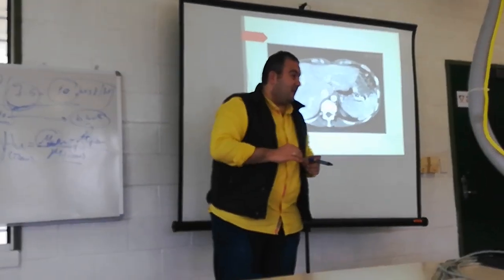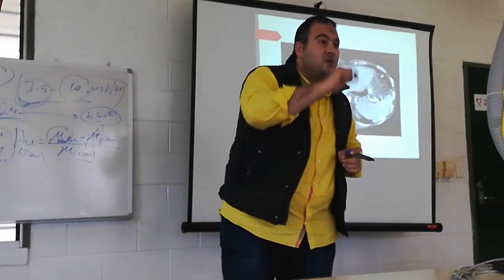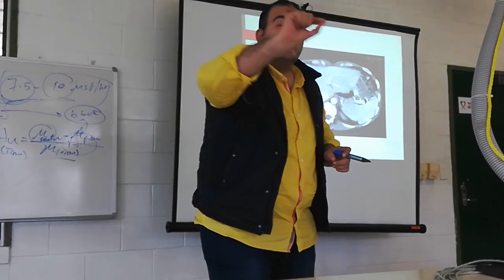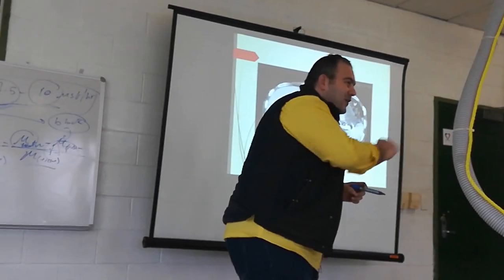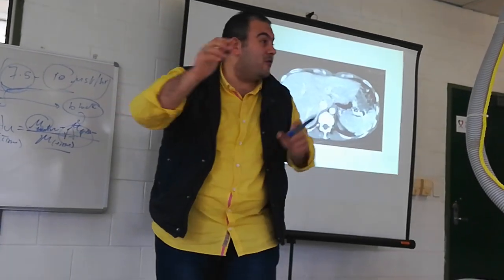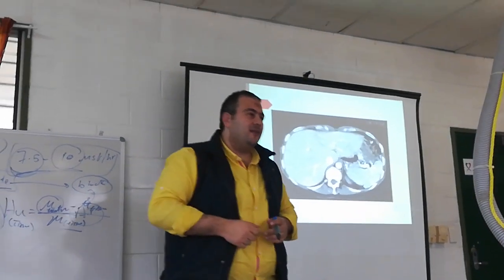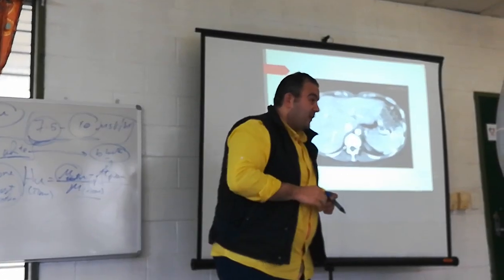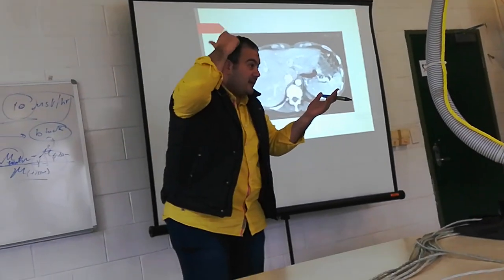For a focal lesion in the liver, there is a specific Hounsfield unit. For a renal stone, specific for urates or the type of crystals formed, there is a specific Hounsfield unit. According to this value, you can differentiate between types of kidney stones. So it's very important to know the Hounsfield unit to differentiate between calcification and hemorrhage inside our brains.